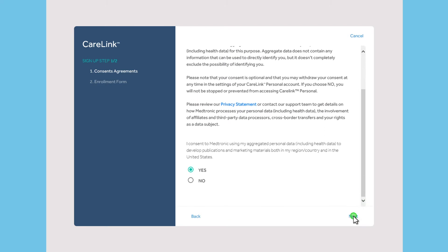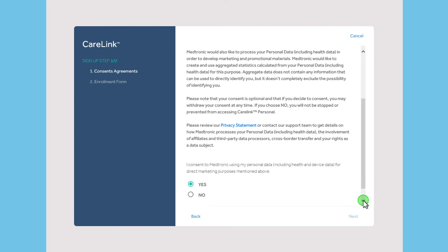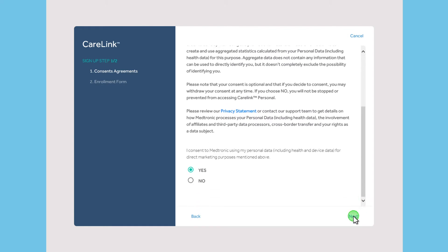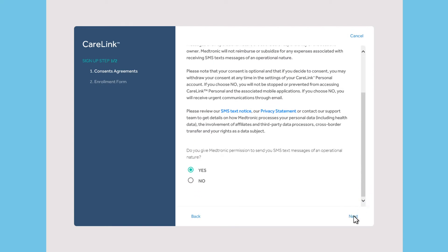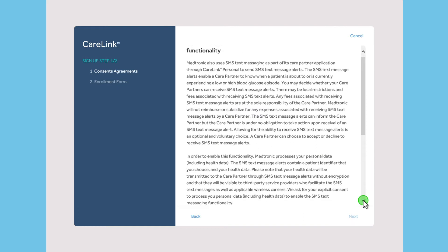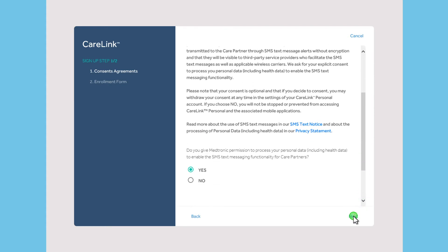These questions tell you what data CareLink software will be collecting and how it will be used. It will also allow you to agree to let your healthcare professional view the data.